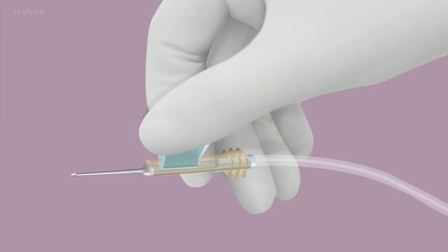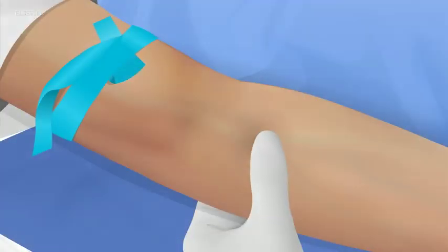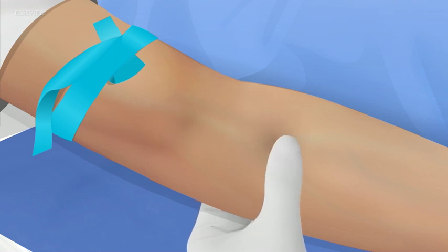Remove the cap from the venipuncture needle, maintaining the needle's sterility. Inform the patient that he or she will feel a stick. Place the thumb or forefinger of the non-dominant hand distal to the venipuncture site. Gently stretch the patient's skin until it is taut and the vein is stabilized.